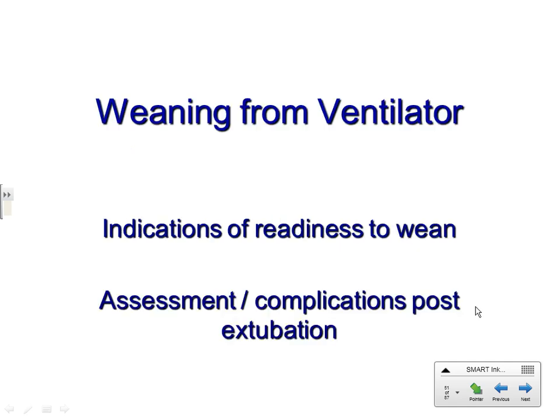And now your patient's ready to be weaned. So what are some of the indications? What are you going to be looking for? Taking spontaneous breaths. So you're going to be looking at that ventilator and see how many spontaneous breaths they're taking. What else? How are their blood gases? Are they improving, given the fact that they're maybe taking more spontaneous breaths? Nutritional status.